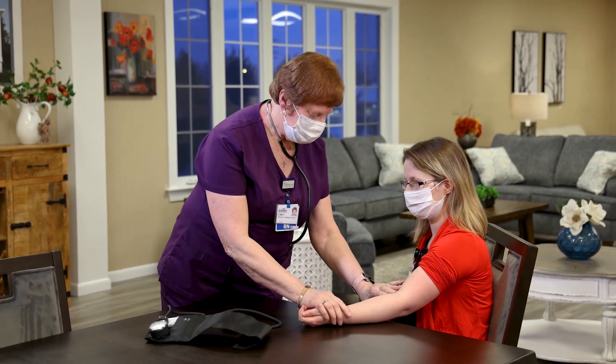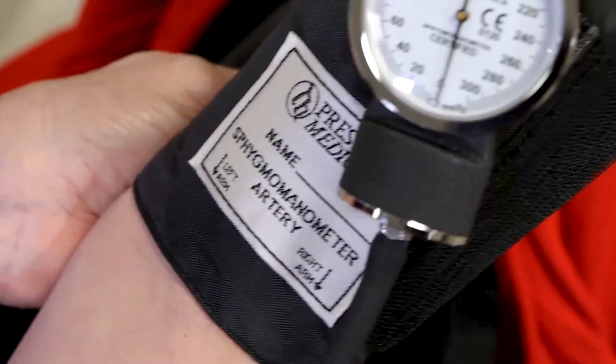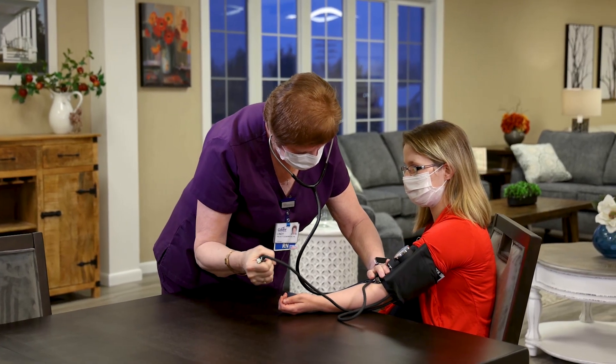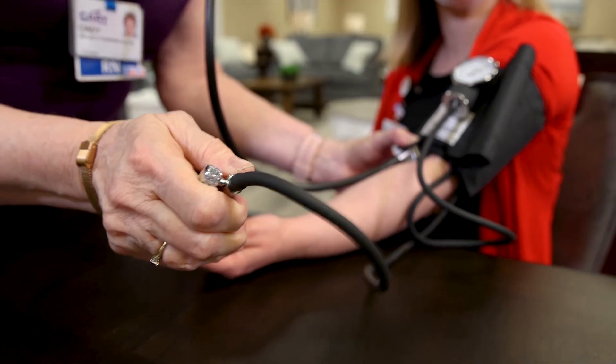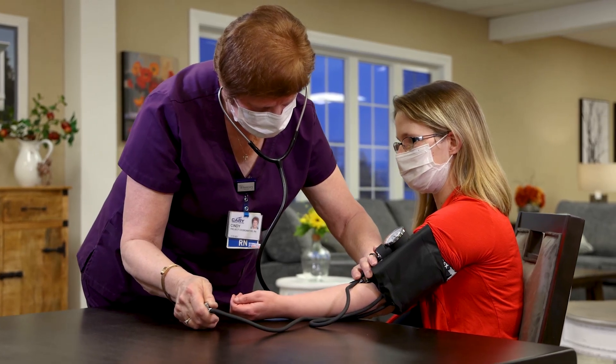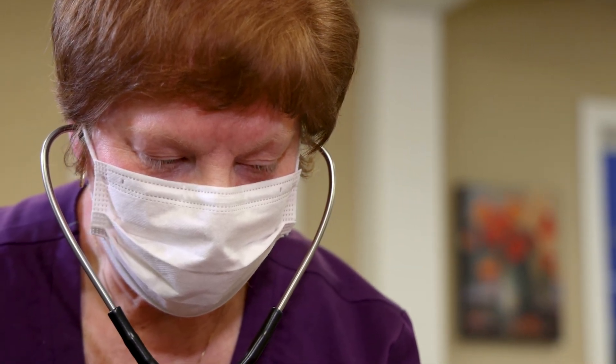The brachial artery is found by taking two fingers and placing them here, where you'll feel the pulsation. You're going to line the arrow up of your cuff above one inch of the brachial pulse, and you're going to inflate the cuff at 20 to 30 millimeters above the point where the pulse disappears. Wait about 15 seconds before releasing the valve, deflate at 2 millimeters per second, and listen for the pulse to start and then its disappearance.